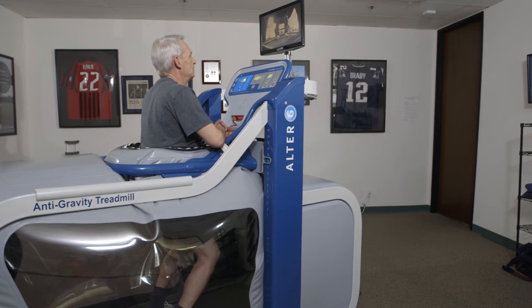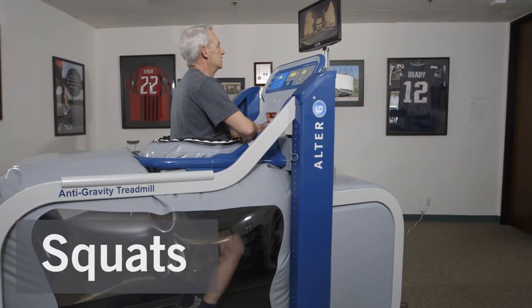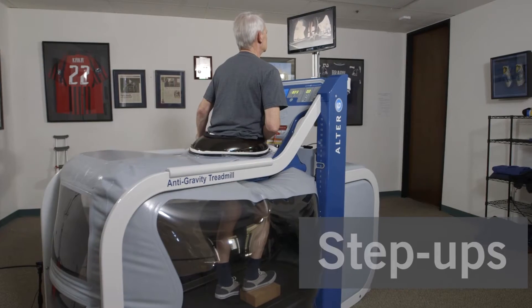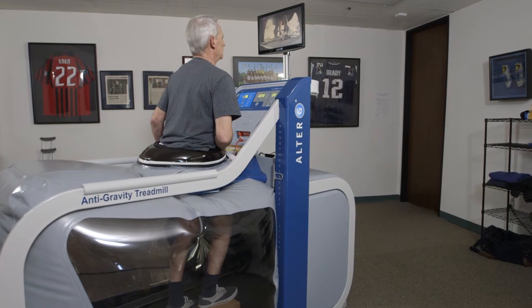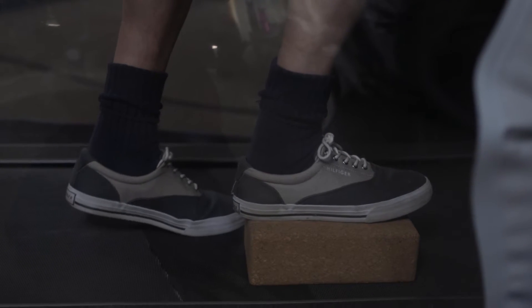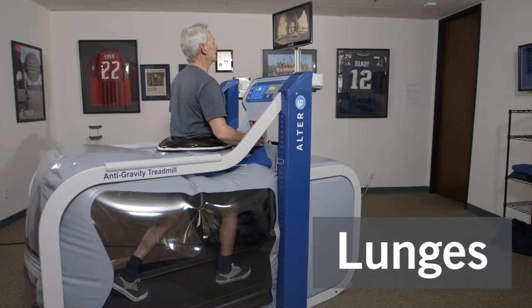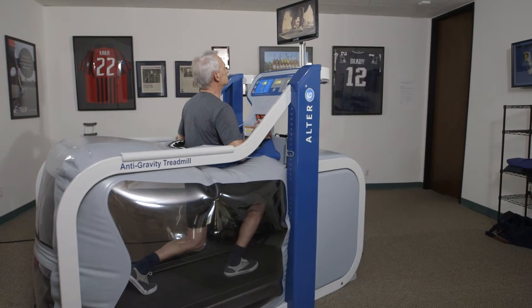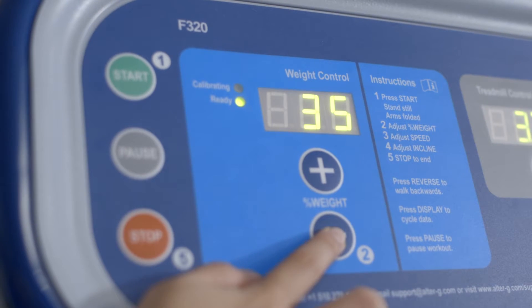Patients may have difficulty tolerating equal weight bearing due to pain when they begin this portion of their rehab. Use the body weight support to perform squats, steps, step-ups, and lunges. Adjust the support as needed for the patient to perform these safely and comfortably.